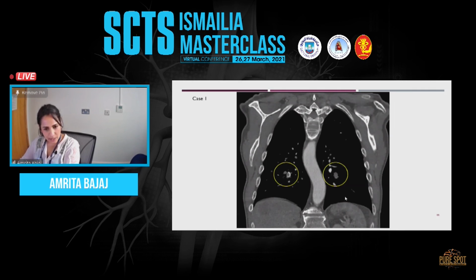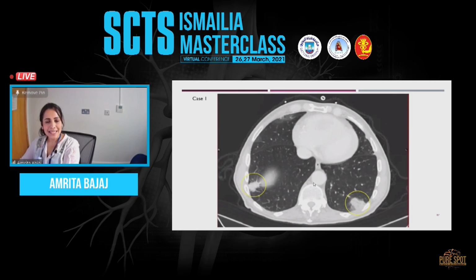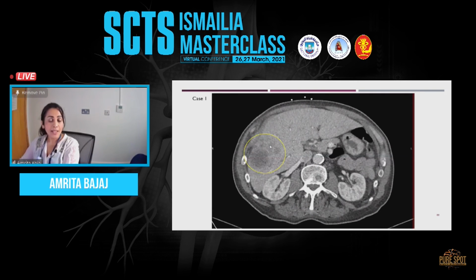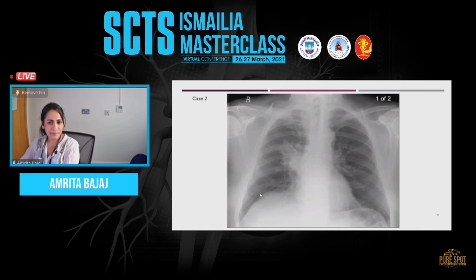A subsequent CT was performed, which showed persistence of the pulmonary emboli. The CT at the same time showed that the nodule had actually become bigger and was spiculated, whereas on the contralateral side there was what was confirmed to be an infarct. In the same patient, you can see that by that time we had liver metastases and several bony metastases, and the patient was not thought to be suitable for surgery.